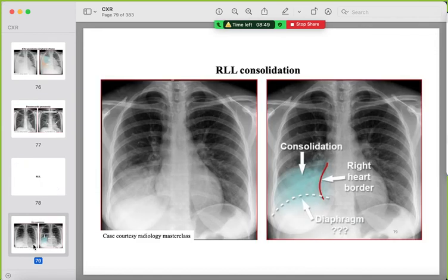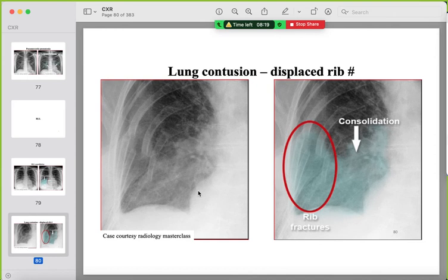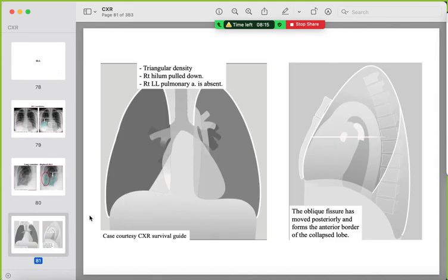Right lower lobe consolidation: parts of the right hemidiaphragm are not clearly seen, but the right heart border is visible, confirming the right middle lobe is intact. If consolidation is associated with rib fractures, call it lung contusion — alveoli filled with blood rather than pus or fluid. Signs of right lower lobe collapse: triangular opacity in the right lower lung zone, the right hilum is pulled down, the little finger sign (right inferior pulmonary vessel) is lost, and the spine black sign is positive.